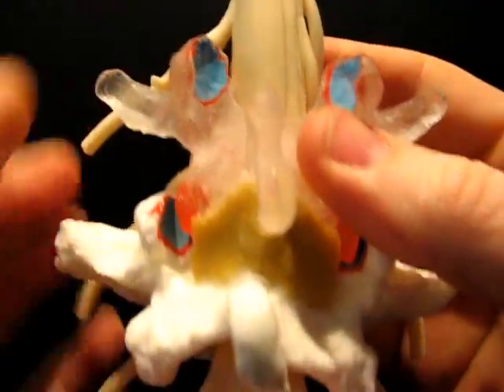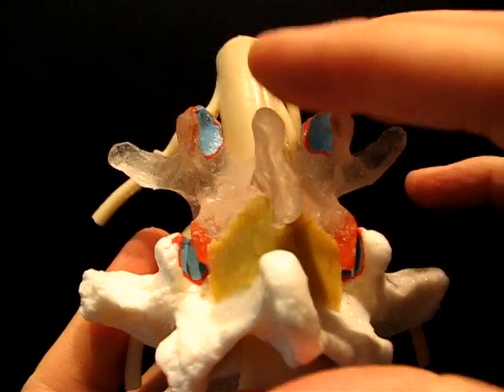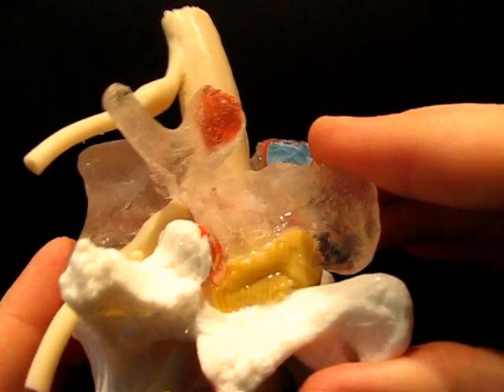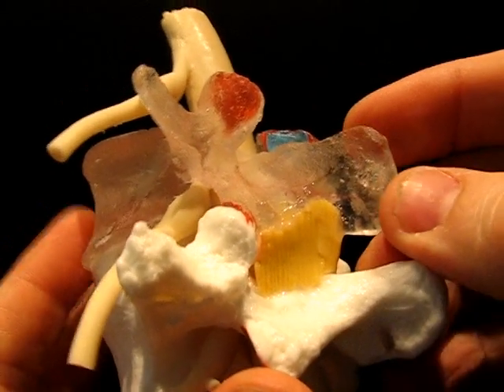Interestingly, when we recently designed the ligamentum flavum for the LXH model, the motion became even more realistic, giving a better understanding of the facets and how they move with respect to the disc.